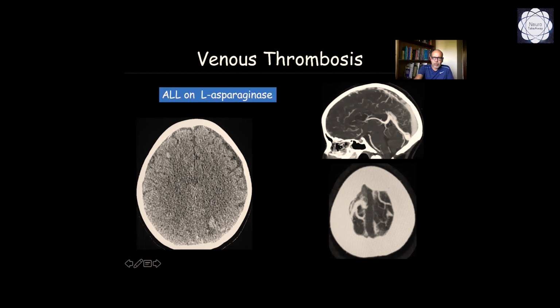When we performed CT and venous angiography, which we do in all these cases because this is a very frequent complication of this drug, we found a thrombus at the level of the superior sagittal sinus. These patients have to receive anticoagulation because this drug is very useful, and they usually keep on with the treatment with this drug.